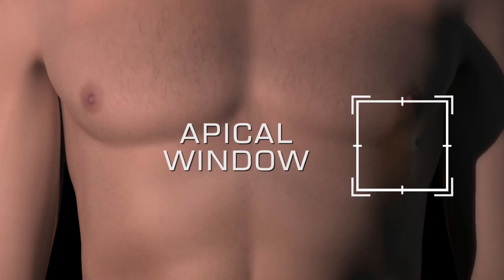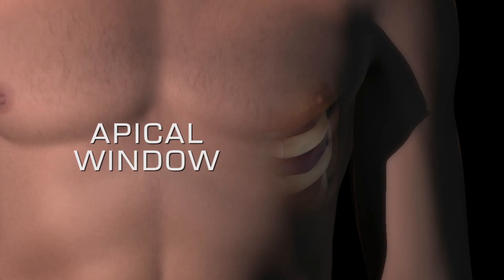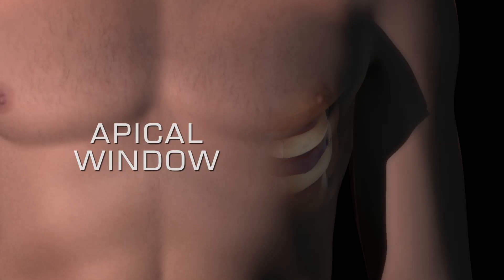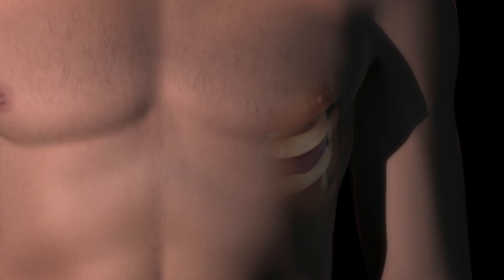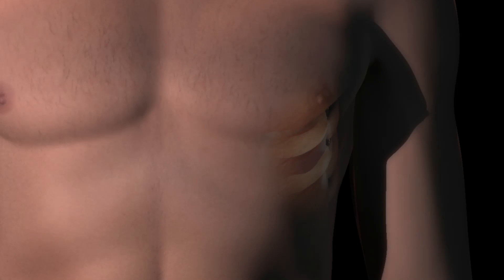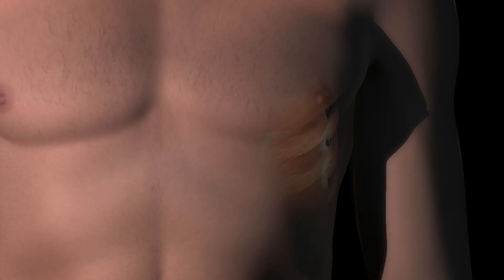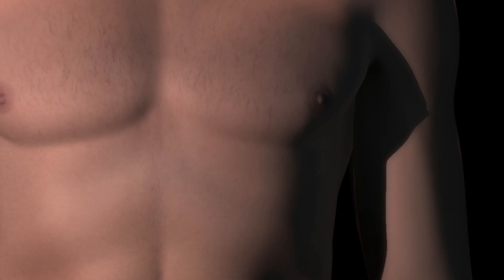The apical window is found in the region below the left nipple. Clinically, the approximate location of the apex of the heart can be found by feeling for the apical impulse in this region.